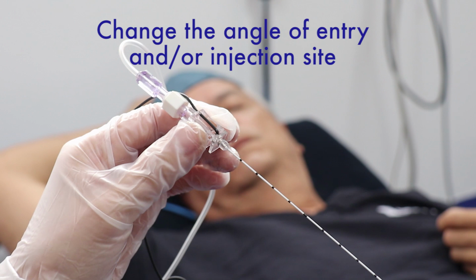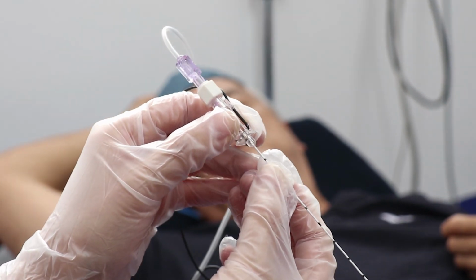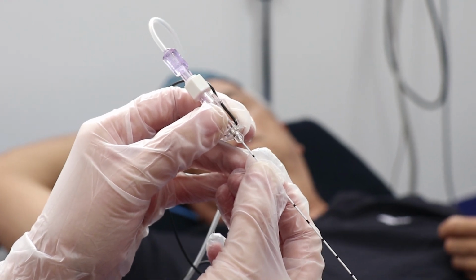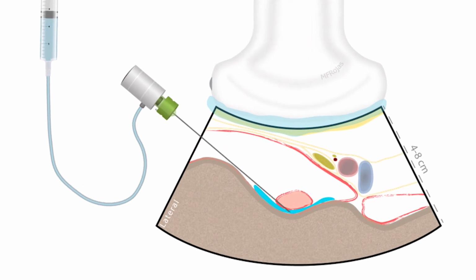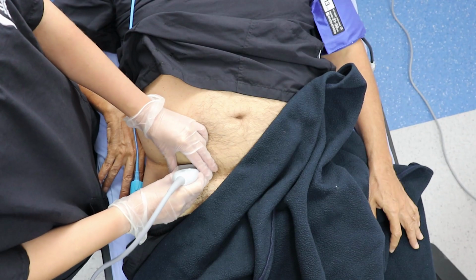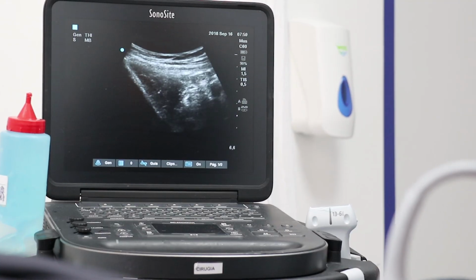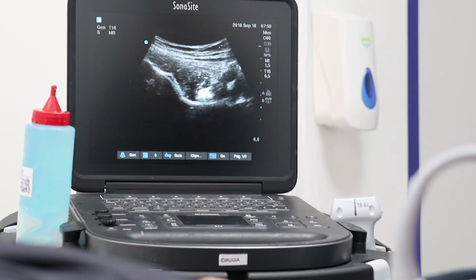Change the angle of entry. Change the injection site over the femoral head. Make sure the spread is just deep to the psoas, but superficial to the joint capsule and ligament. While the local anesthetic is being injected, lifting of the psoas muscle should be identified.